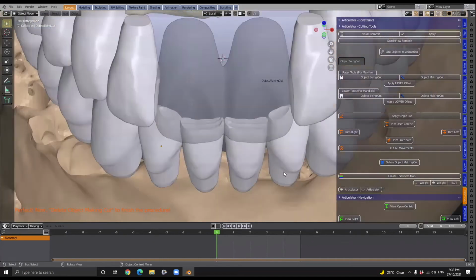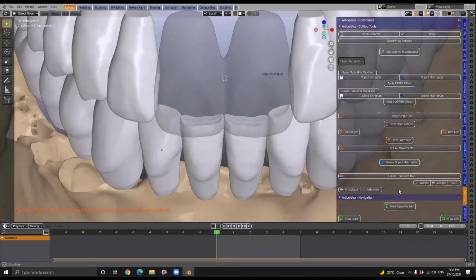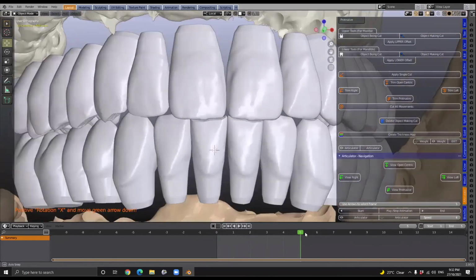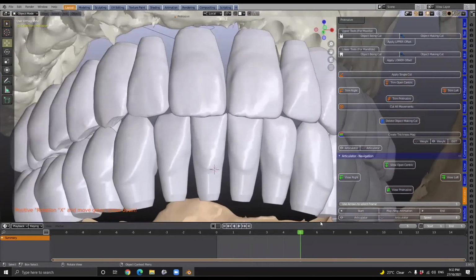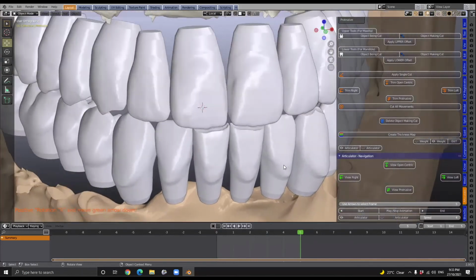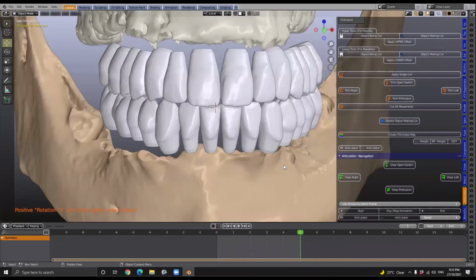So here's a question, Mike. In regards to crown and bridge work, say you've got a big case like a full mouth rehab, for example, would you suggest we cut the tooth library, the bite of that, before we go and make the crowns, or during the procedure? What is easier, or is it just much ado about nothing?